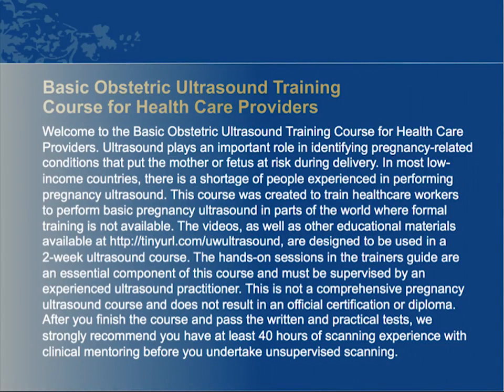Welcome to the Basic Obstetric Ultrasound Training Course for Healthcare Providers. Ultrasound plays an important role in identifying pregnancy-related conditions that put the mother or fetus at risk during delivery. In most low-income countries, there is a shortage of people experienced in performing pregnancy ultrasound.